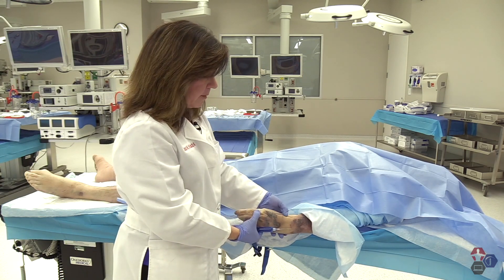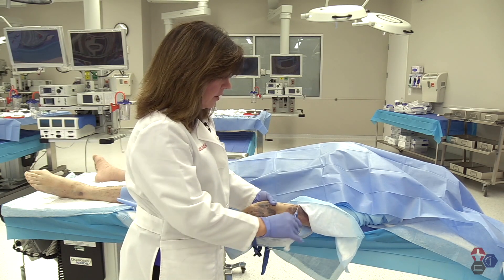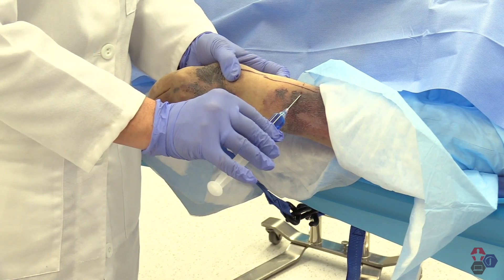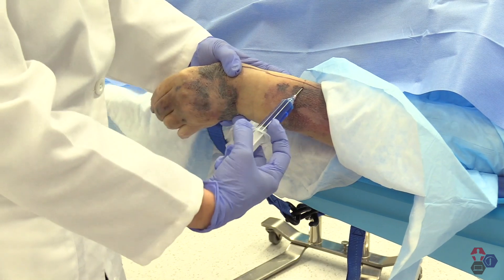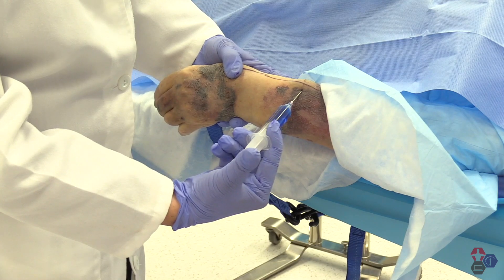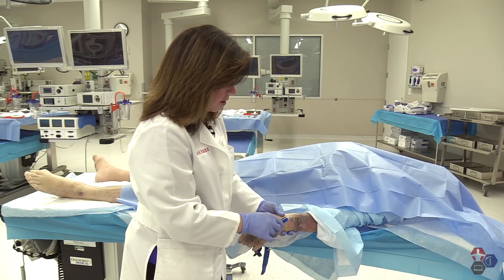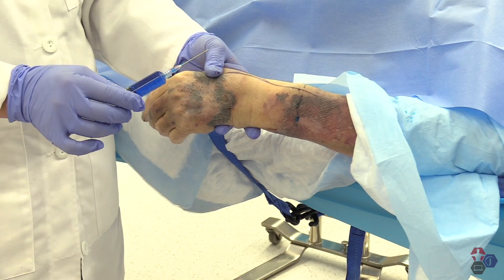I've identified my anatomical snuff box, my radial styloid, I've gone two finger breadths above, I've drawn a visual axis where I'm going to go. I'm going to stay very superficial, and I keep my finger on the radial artery so I'm not going to penetrate it. I'm going to go across that trunk, aspirate, and then lay down a wheel as I withdraw. You can see on this patient there's a large blue wheel right over where I think that superficial radial nerve trunk is.